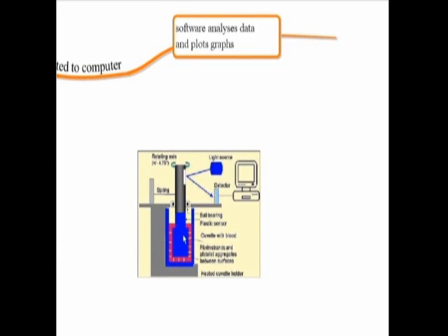And then this rotating axis here starts rotating from side to side at 4.75 degrees, left and right. And while it's doing that, can you see these little lines here? These are fibrin strands and platelet aggregates between the surface of the cup and the surface of the pin.